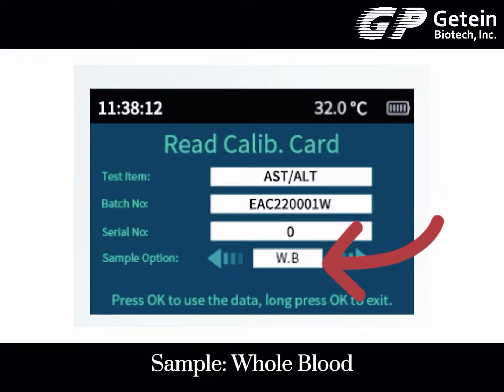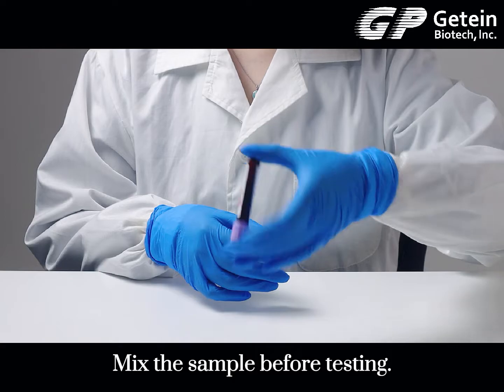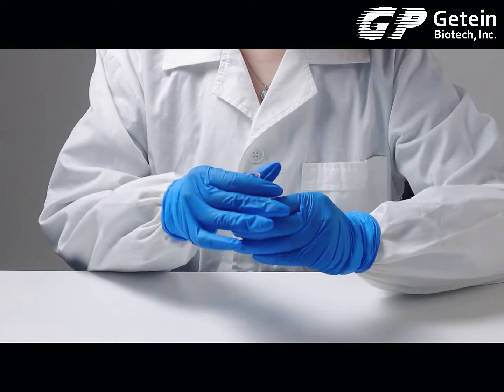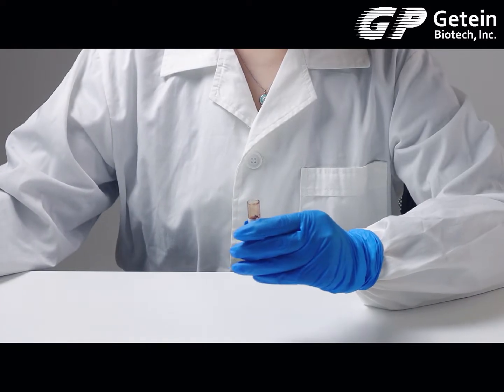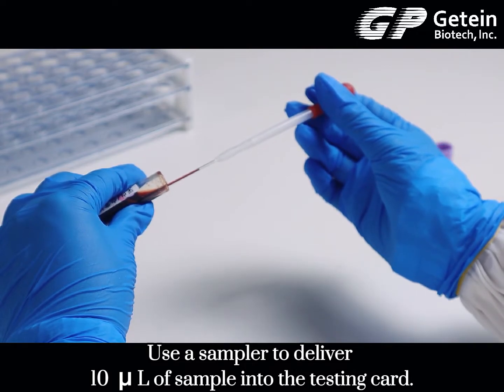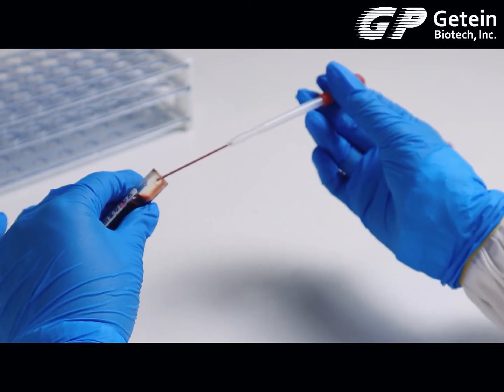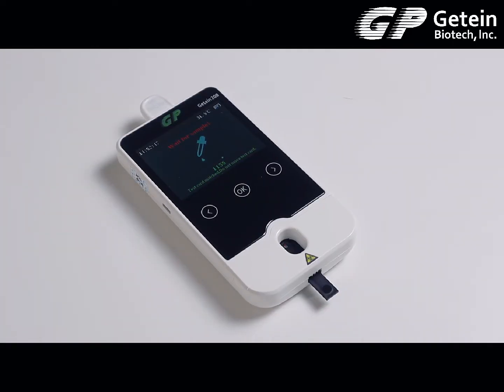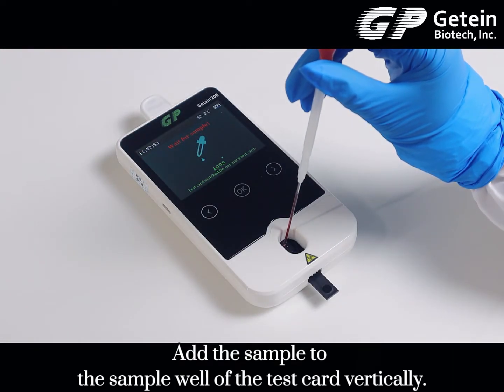Sample whole blood. Mix the sample before testing. Use a sampler to deliver 10 microliters of sample into the testing card. Add the sample to the sample well of the test card vertically.